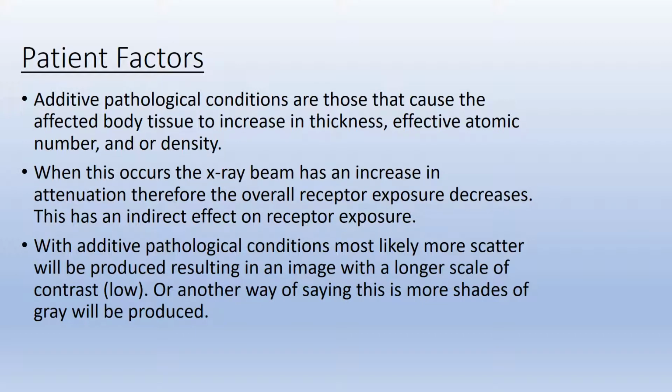With additive pathological conditions, most likely more scatter will be produced, resulting in an image with a longer scale of contrast or low contrast. Another way of saying this is more shades of gray will be produced.